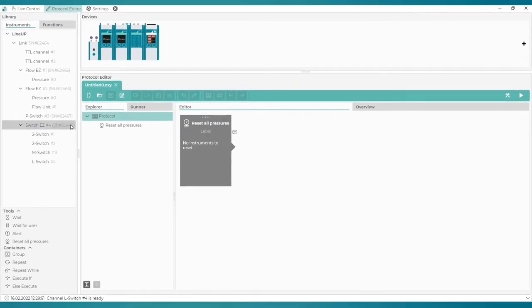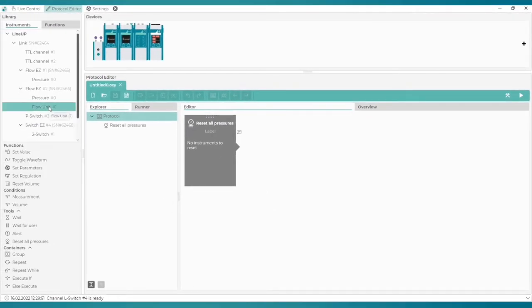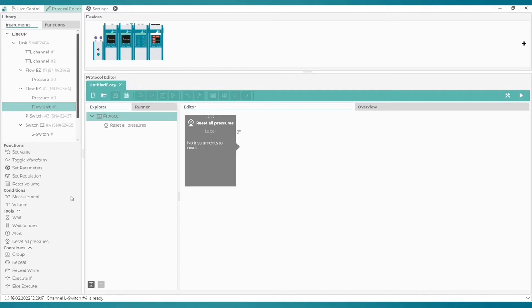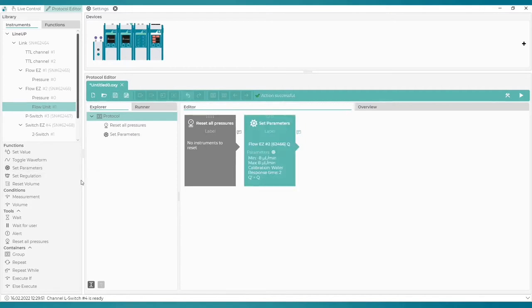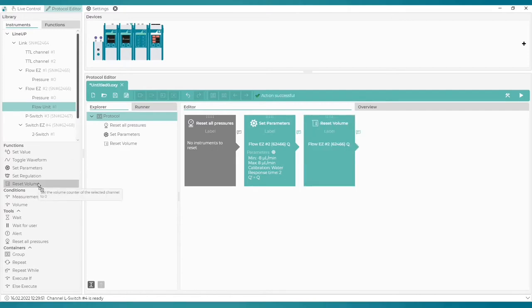We must first add any flow unit block to make the flow rate monitoring window appear in the overview tab. So at the very beginning of the protocol let's select a block Set parameters from the functions list. The last preparatory block before setting the pressure is the Reset volume tool which will be used to start a new volume measurement.